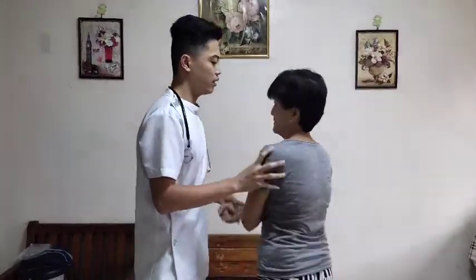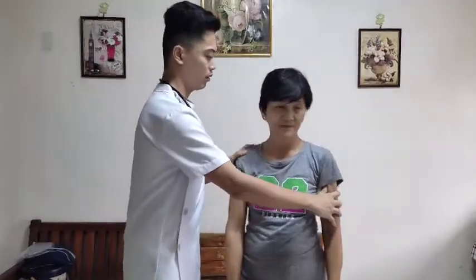So the next is the auscultation. You always auscultate the breath sounds of the lungs or the heart sounds of the patient if you use a stethoscope. But before that, we're going to auscultate the back of the patient.